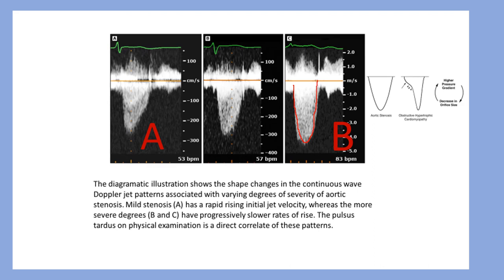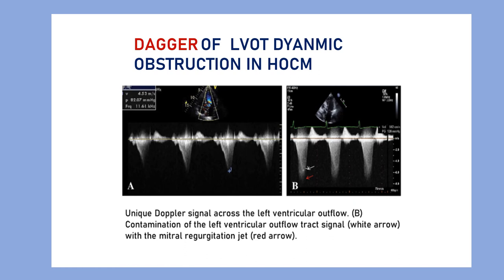After valvular aortic stenosis, the Doppler signal of left ventricular outflow tract obstruction in hypertrophic obstructive cardiomyopathy is quite distinct, with late peaking of the velocity curve. Because of the subvalvular or mid-cavity obstruction, the late peaking results from the Venturi effect, which pulls the anteriorly displaced leaflet of the mitral valve into the outflow tract, resulting in late peaking of the outflow signal in hypertrophic cardiomyopathy.